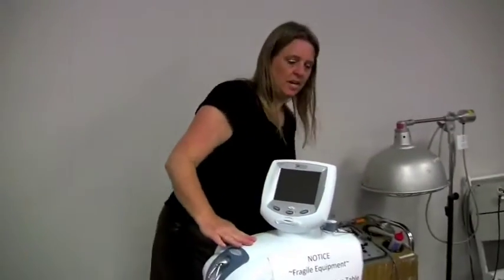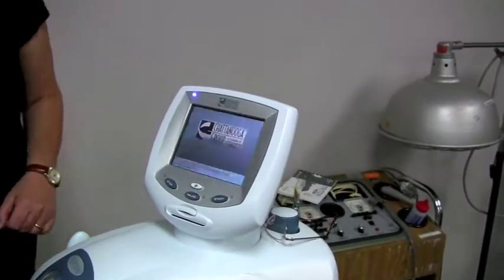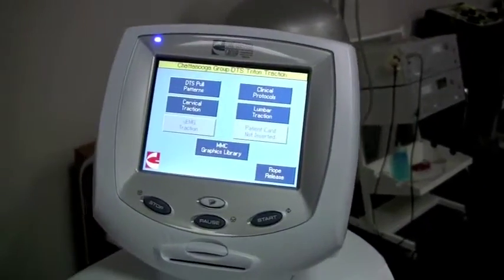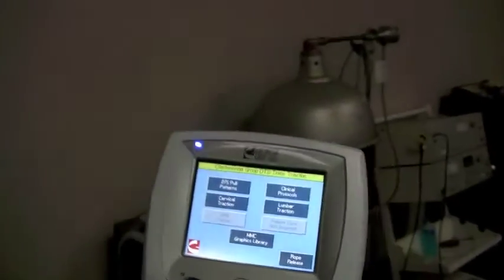First we're going to come over here to this apparatus right here. The on switch is on the back, and it should come up in just a second. As you can see, the table has the computer part, and it also has things like this kill switch right here.